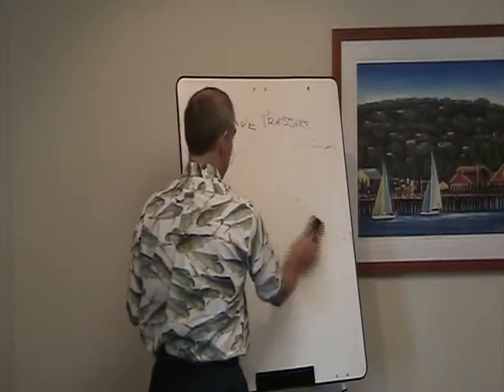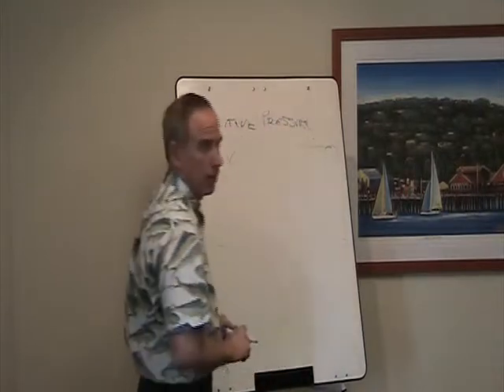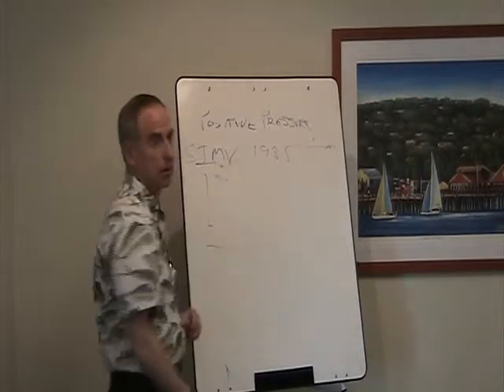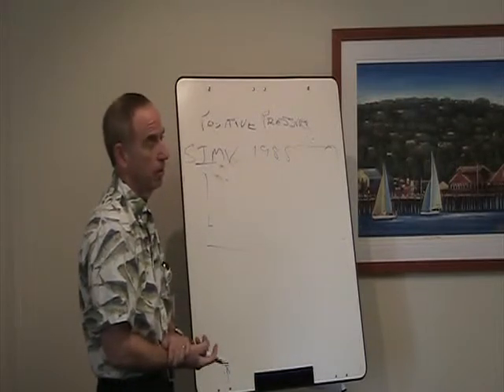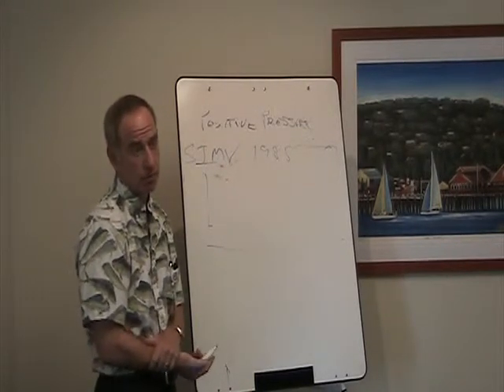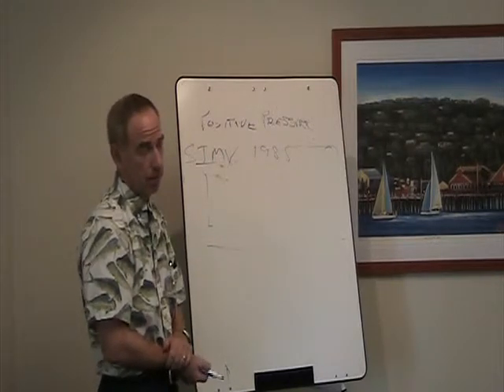All right, so what was the next major type of ventilation that was developed after that? Now you're moving into the mid-80s, so about 1985. What, BiPAP? No, that's probably a little later, but close. CPAP. Well, okay, so is CPAP a mode of ventilation? No. CPAP is just continuous positive airway pressure. CPAP was available years before that, as was PEEP.